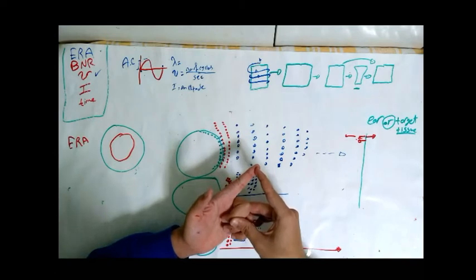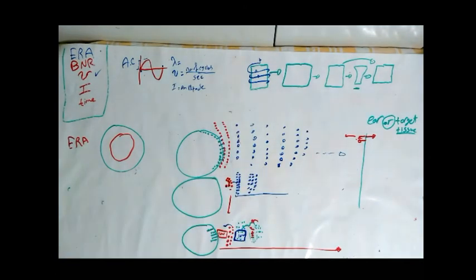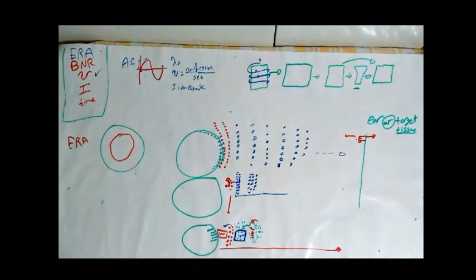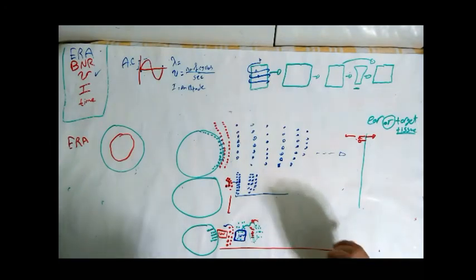If I'm increasing the pressure on the joint, I'm increasing the joint space more and more and forming a larger and larger bubble. And finally, it is going to explode. This is the same mechanism which happens at the level of the target tissue. It is like a balloon. I can blow up the balloon.